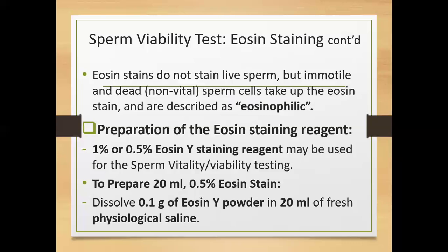You get it. So the reagent that you are going to prepare, the medium of the preparation, should be physiological saline or isotonic saline. You can't use ordinary water to prepare your stain, because you are going to demonstrate viability, whether something is dead or alive. If you use ordinary water, the water will kill it, and then the stain will also stain it. Then you would say all the sperms are dead. You get the concept. That is why you use saline as your medium for preparing your reagent.